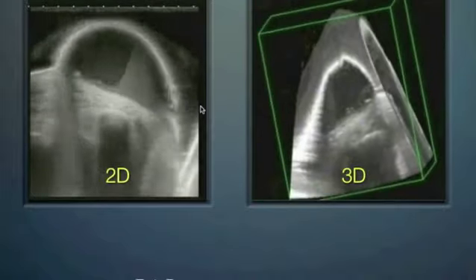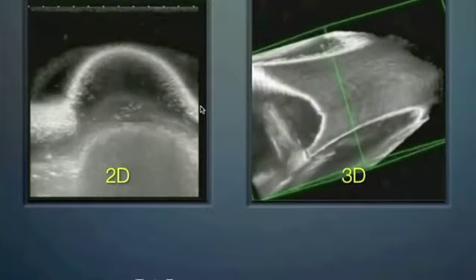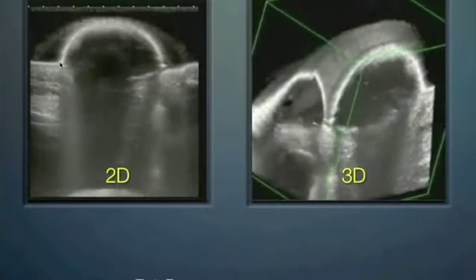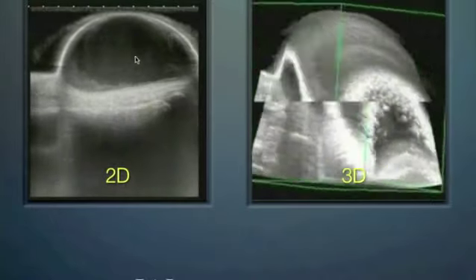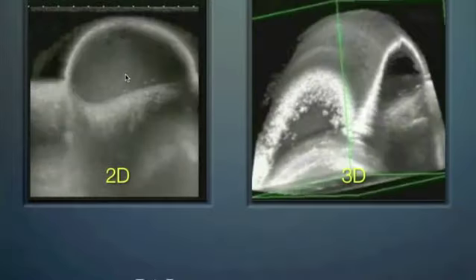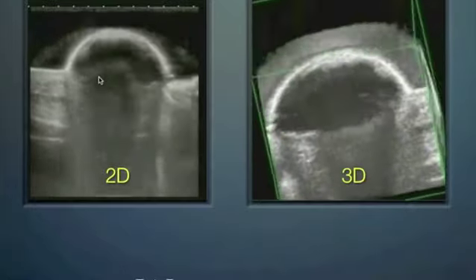And this is an example of somebody who has a large hemorrhagic bullae on their foot that was dunked in a water bath mixture. And this is the 2D image of that structure here. We're fanning through that. All this meniscus that you see there, that's all the hemorrhagic material. We get very good visualization in the two-dimensional mode.